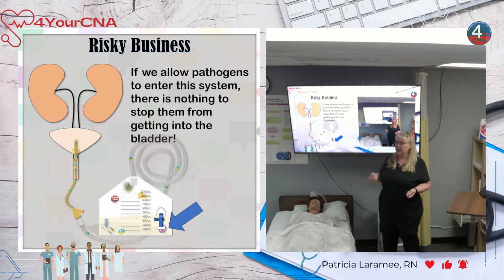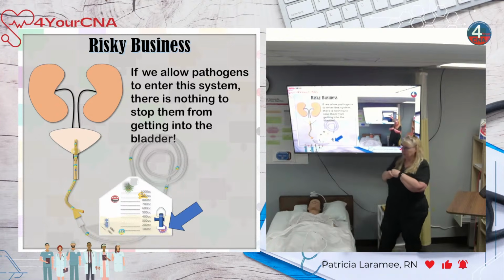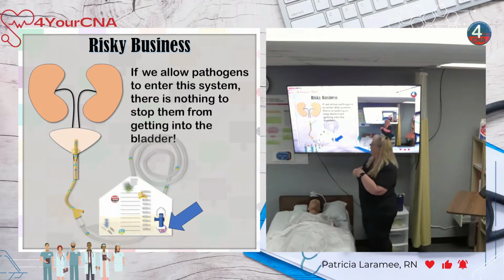Now it could hurt more if they have an enlarged prostate, because now we've got a boulder that we have to route around. Still same urethra. We're not drilling for anything, but we kind of have to route around that enlargement. Okay, good, makes sense?